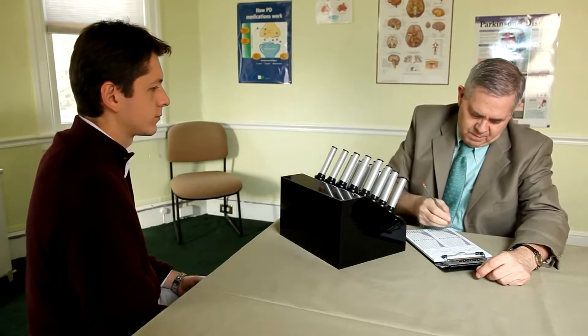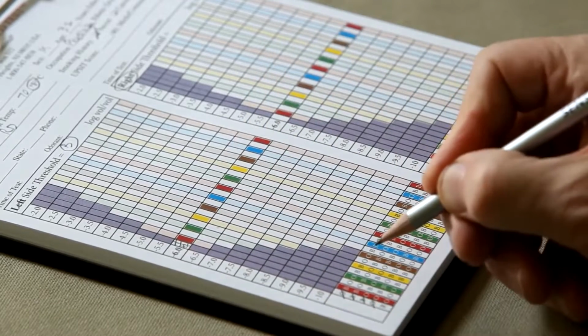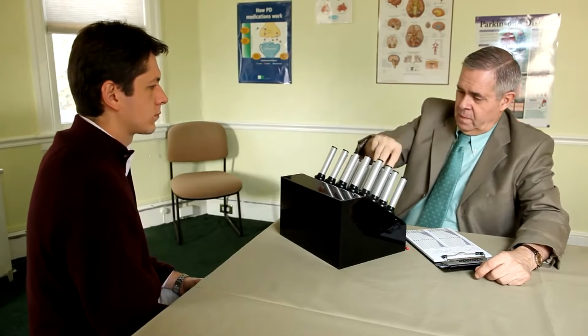The first one. First one. And the second one. The second one.